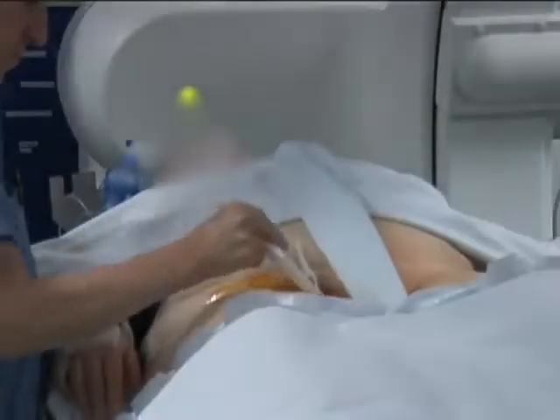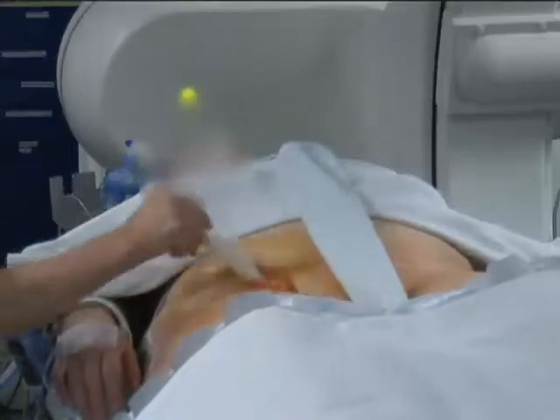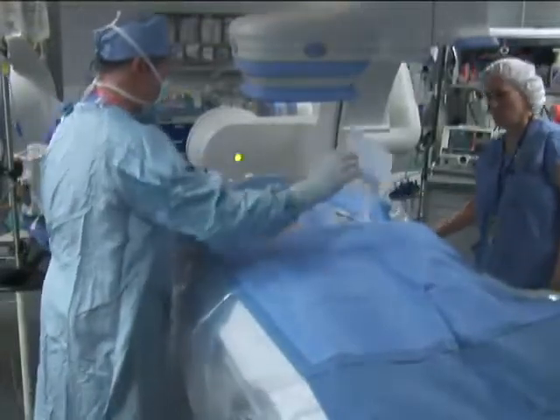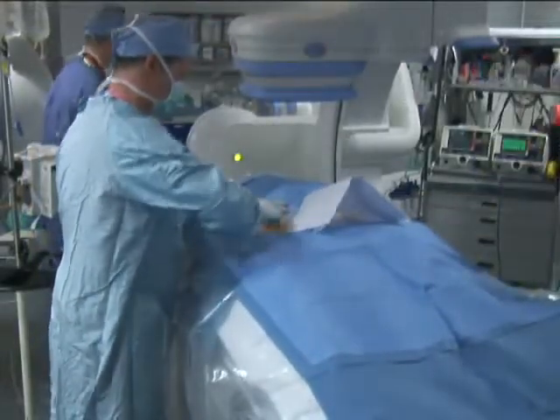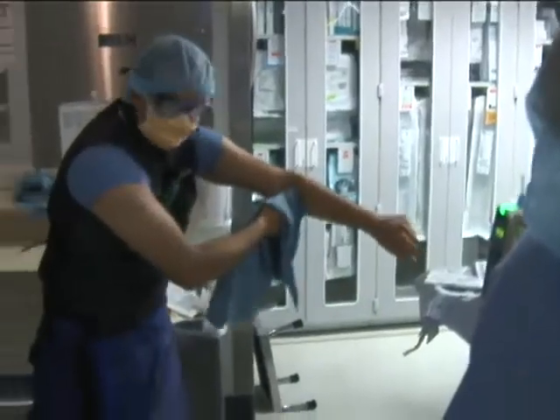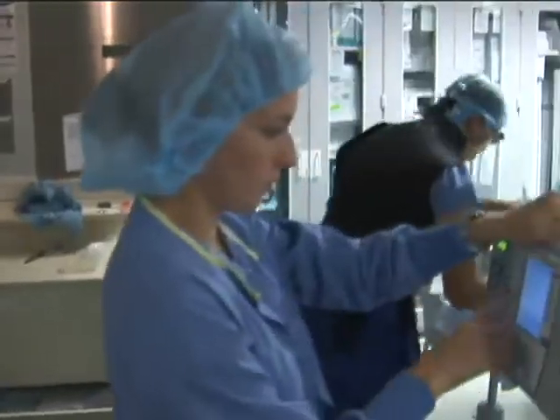The patient is then prepped in the standard fashion. Here we are entering only from the femoral vein, so the bilateral groins are prepped, though some operators may choose to access the internal jugular or subclavian veins as well. After prepping the areas for venous access, sterile draping is applied. The operator performs a sterile scrub and dons a sterile gown and gloves.